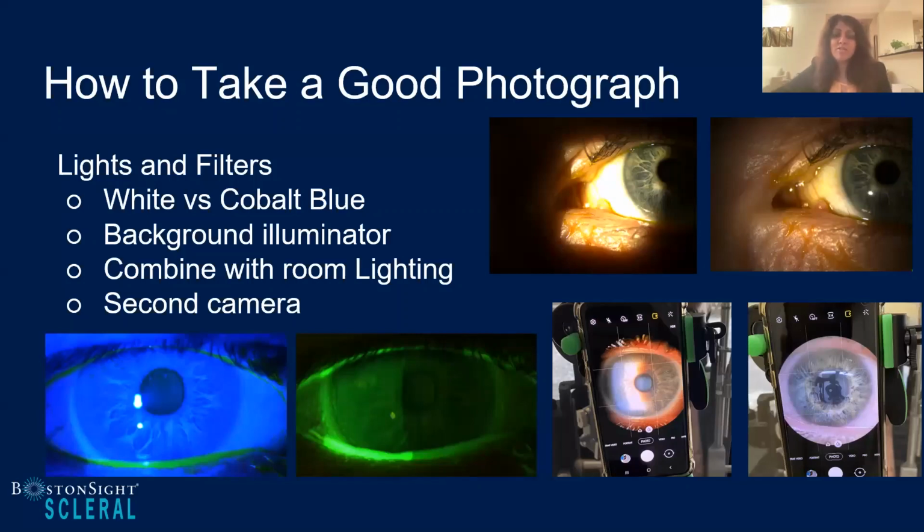Down here at these two photos, on the left, we have that image of the cornea that we're seeing through the smartphone, and this is with the slit lamp light on. What I then did was turn off the slit lamp light and turn on the room lighting to get a picture of the same cornea with just ambient light. That room light gave me such a different perspective on these images. You can play around with the lights in the room being down, up, slit lamp on versus off, and see what type of images you get depending on what you're trying to photograph.